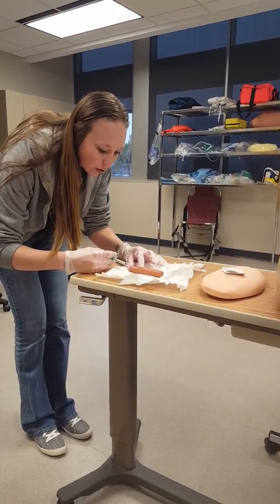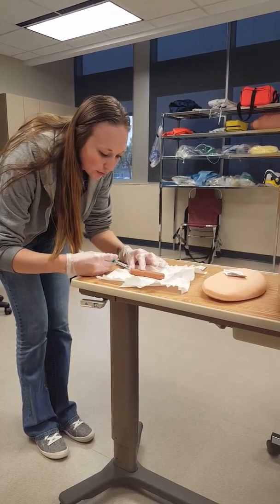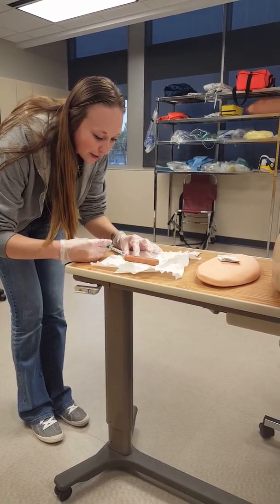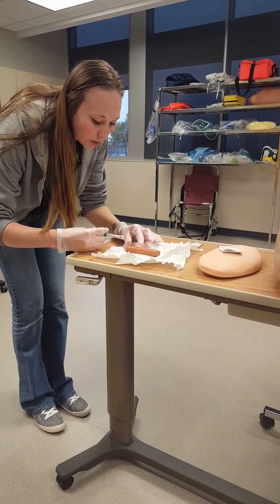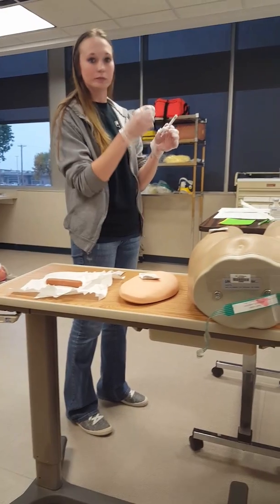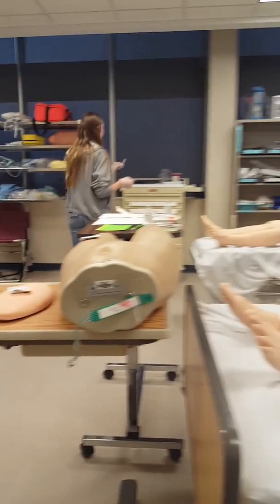And I don't have to stick it all the way in, and then I would do it to get my bleb, my hot dog split. And then I would pull out. And for this, when I'm done, I would put a safety lock on it, and then I would put it in my sharps container.